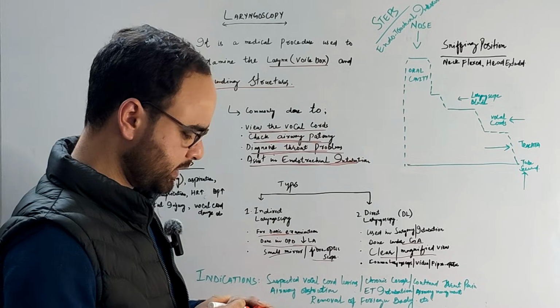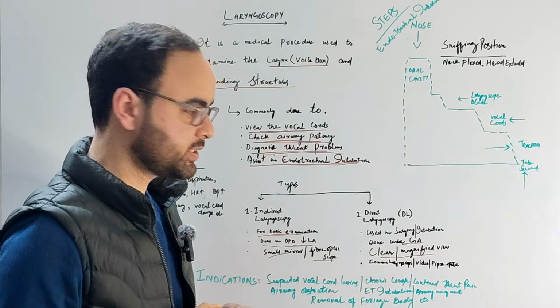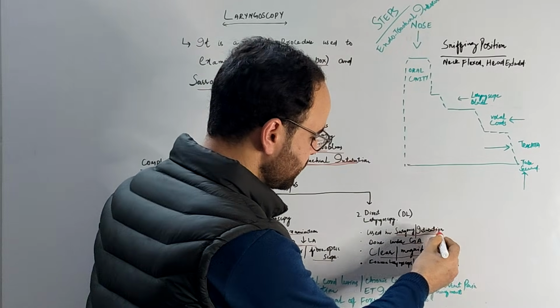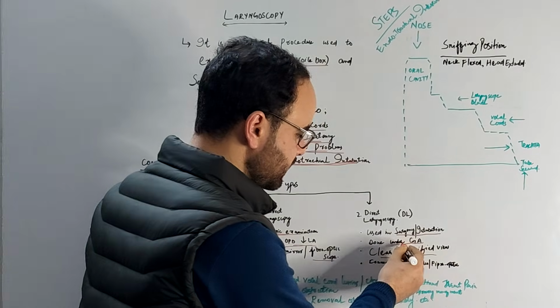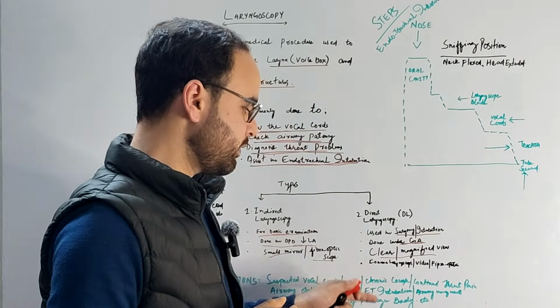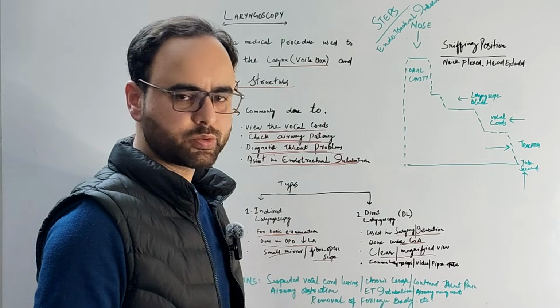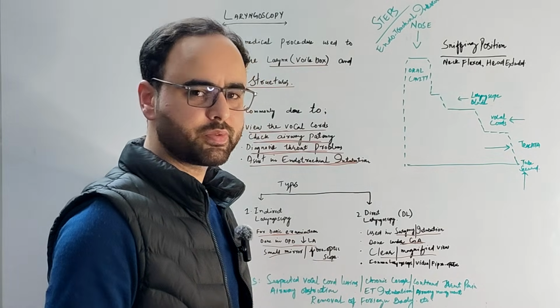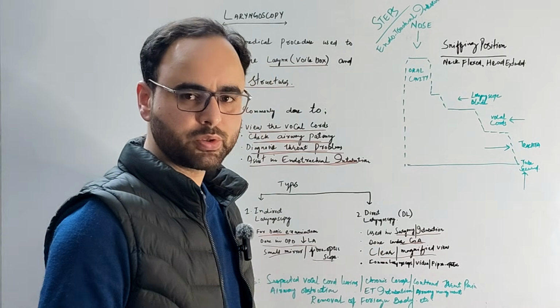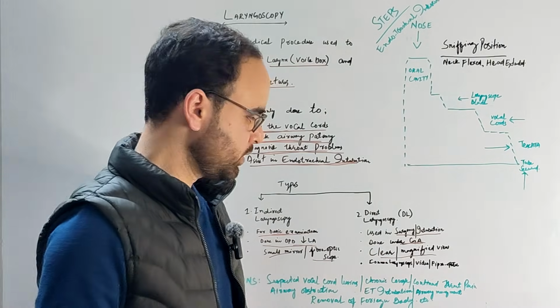In the direct laryngoscopy, sometimes loosely called DL, it is done in surgery and intubation, under anesthesia. Here we have a clear and magnified view with the help of a variety of laryngoscopes, which include the common laryngoscopes with McIntosh blade, Miller blade, and of course the video ones, which include CMAC, McGrath, and fiber optic.